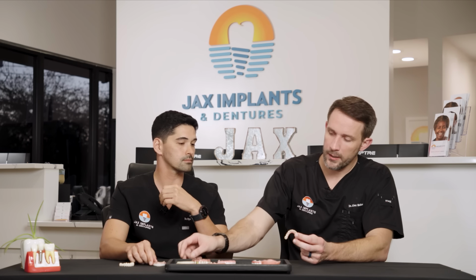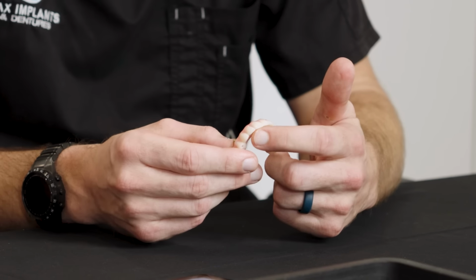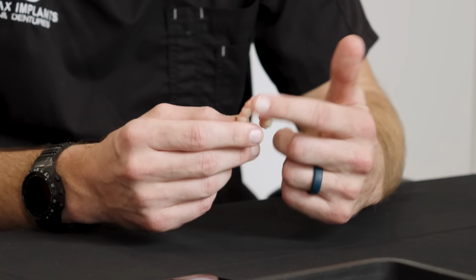This is much, much heavier, but looks-wise is great. You're like, okay, but why do I want something heavy? This is a little more porous. I would think this is more like Tupperware. It's still strong, but it's not like glass. Think of when you put spaghetti sauce in glass or Tupperware, right? You wash it, but you can tell. So over time, a temporary is a little more porous. Even though you're brushing and doing everything to keep it clean, it's going to stain. It's a little bit weaker, but it looks fantastic at the beginning.